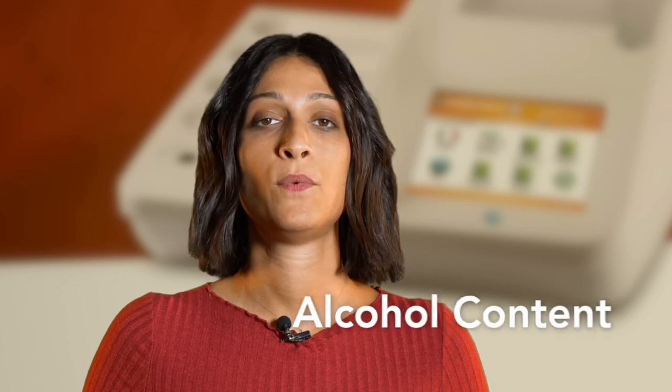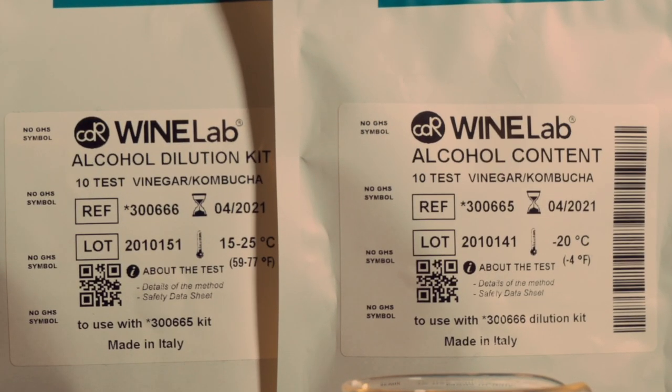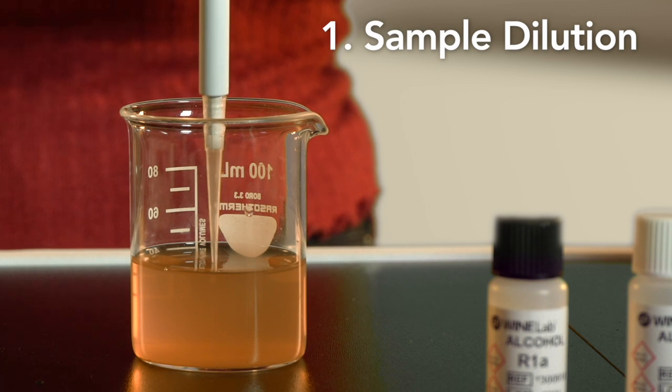The analyzer is already calibrated and ready to use. To show you how CDR Kombucha Lab works, I will perform the alcohol test on Kombucha. After degassing the sample by using an ultrasonic bath, I'll do a simple dilution.